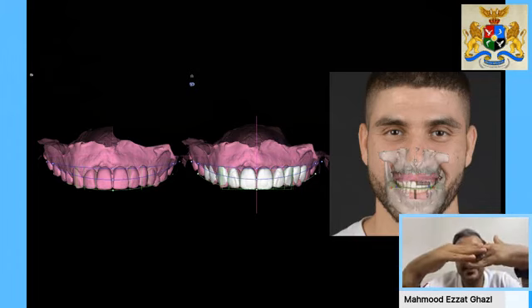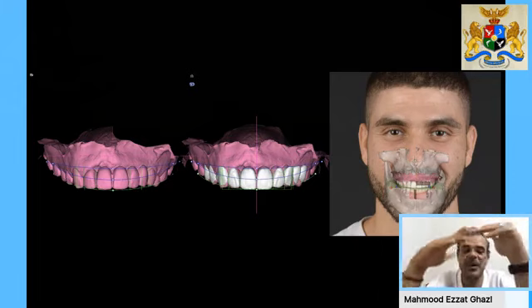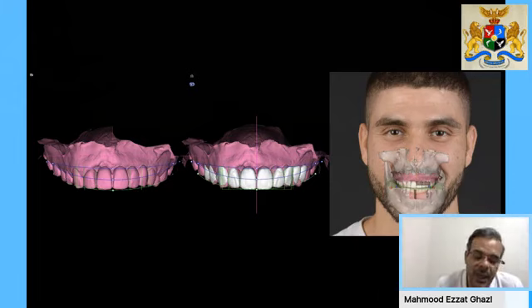So we are planning that the gingival margin has to be above the patient's upper lip, so that the demarcation between the pink porcelain or pink composite, or of course in this type of case a pink composite because it's a partially edentulous case, needs to be below the level of the patient's upper lip and where the new papilla levels are. What's in white is where his future teeth are going to be, and what's in pink, of course, is where he is right now. So there's a big difference between both.